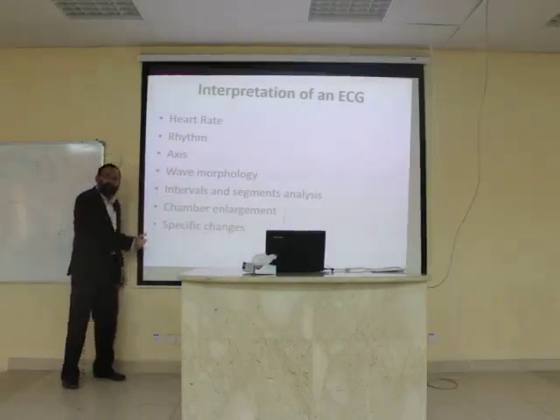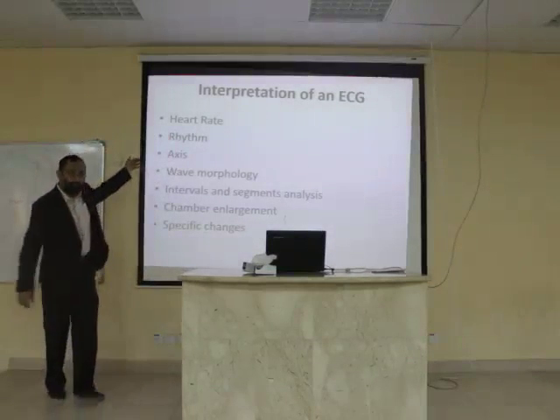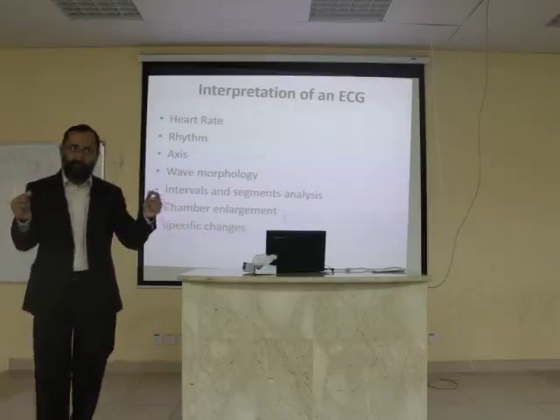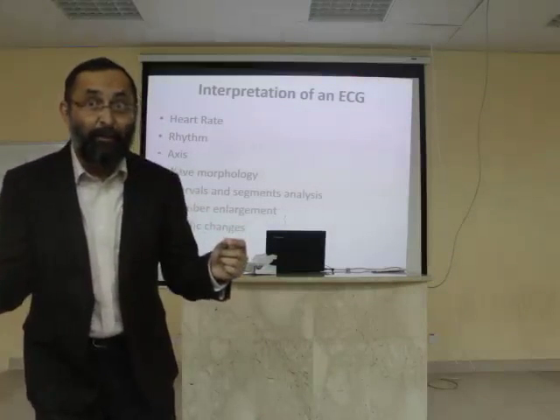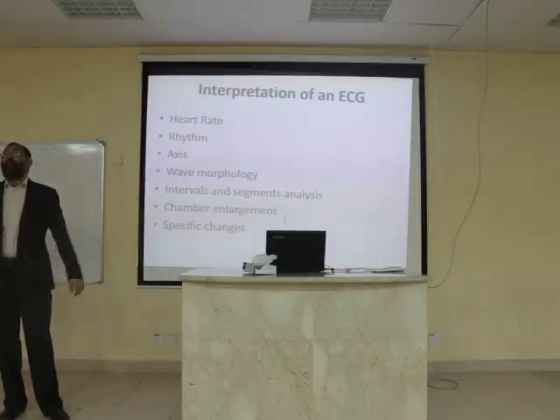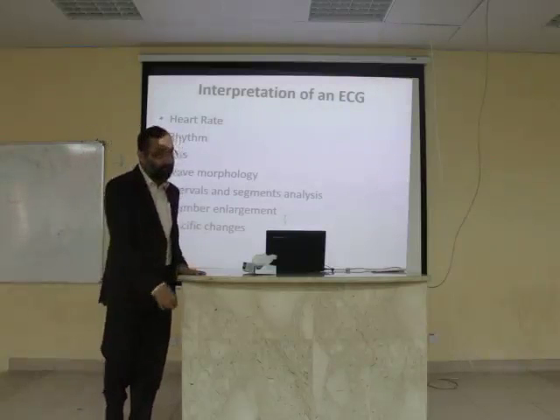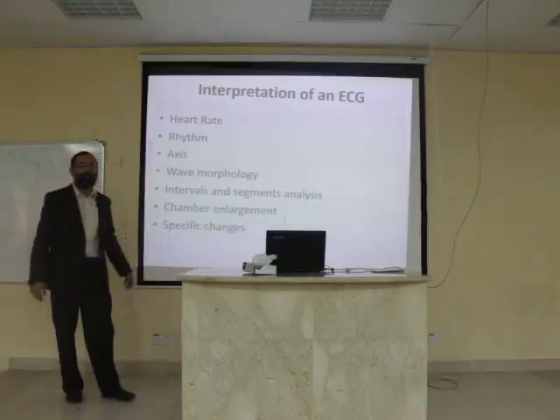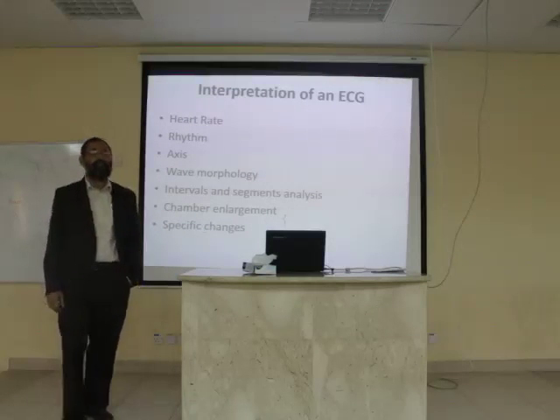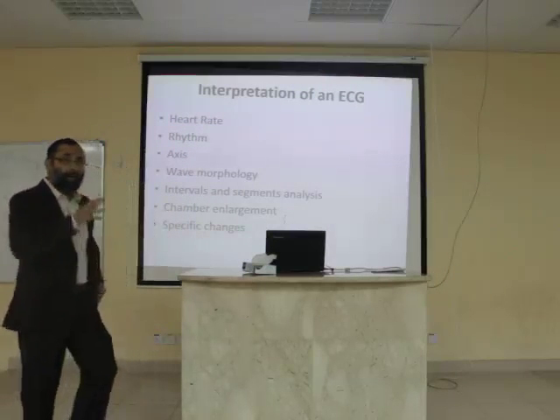This is the protocol that you have to see in an ECG when you are becoming a clinician or you are going for the training in the wards. So from all these angles, you have to see the ECG. Intervals and segments analysis, you will quickly calculate whether intervals and segments are normal or not. Chamber enlargement, okay? ECG changes tell you about the hypertrophy or increase in size of the chambers also. So you have to see from the electrical activity whether chambers are normal or not. And there are some specific changes regarding toxicity and ionic disturbances, electrolyte disturbances.